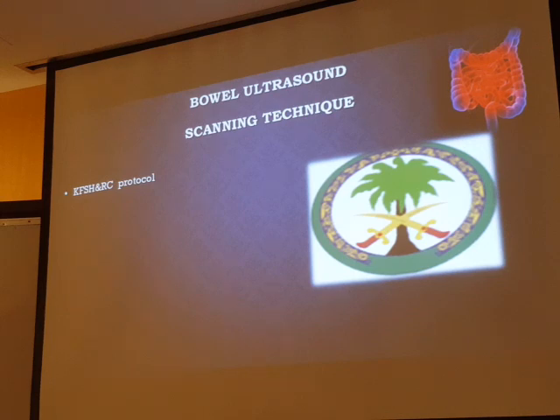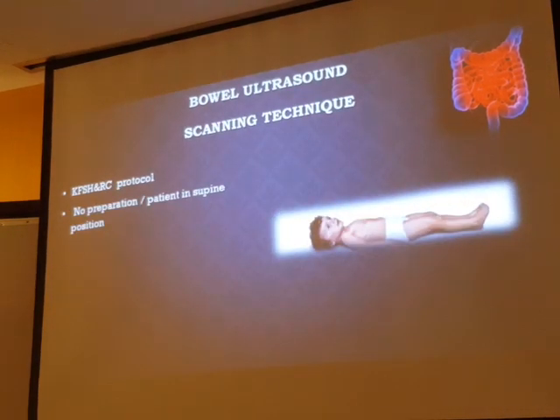Each hospital has its protocol. For me, the protocol is very important. The protocol, what is it? It's a sequence of images. It's usually written by the radiologist and signed by the radiologist, to make sure you are covering the whole area that needs to be covered, that you are providing all the information needed to provide, and it's easy for a second study for comparison. So the protocol, we should memorize it, and we should follow it, and we should take every sequence of the image.